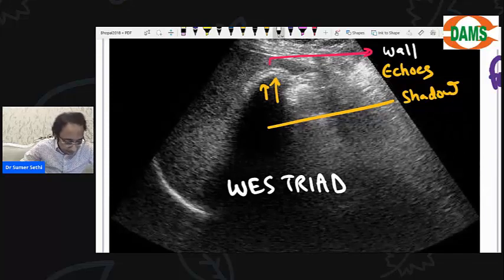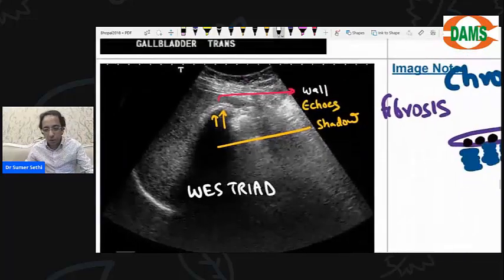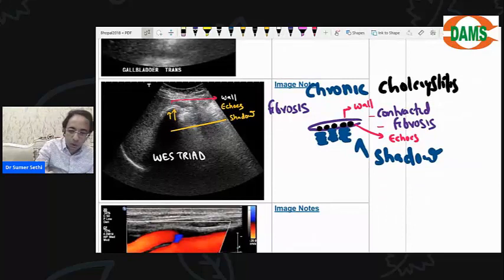Okay. Some of you are asking कि सर कोलेसिस्टाइटिस में एमआरआई क्यों नहीं? बेटा जब अल्ट्रासाउंड पे पता चल ही रहा है तो फिर एमआरआई तक क्यों जाए? Okay. Now let's see. Gallbladder तो देख लेना बेटा, acute और chronic तो साथ में देखना पड़ेगा ना.